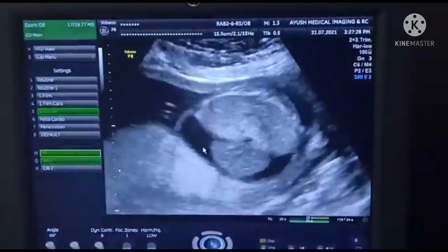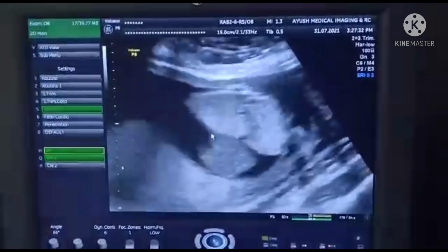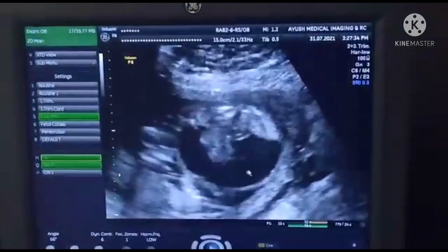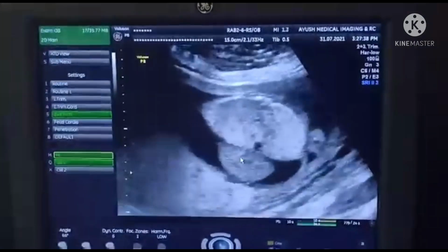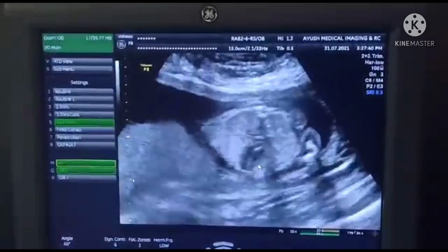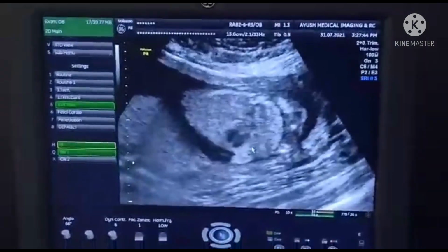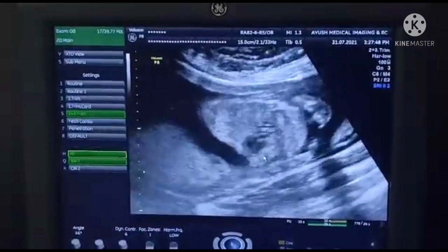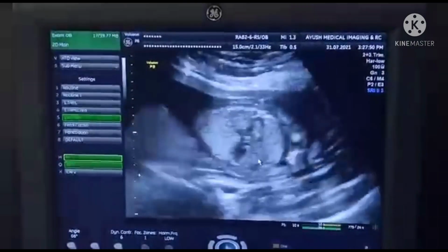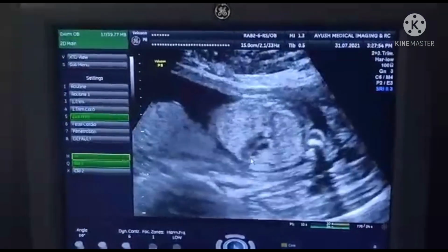So there is a gross fetal ascites, tense fetal ascites with thinned out abdominal wall. If we carefully see, this is a thinned out abdominal wall in which these are floating, and then when we look at the fetal cardia a little more carefully, we start appreciating that there is a small echogenic focus seen here.